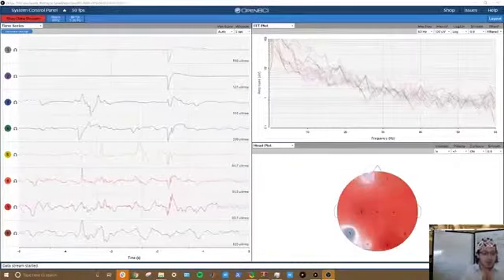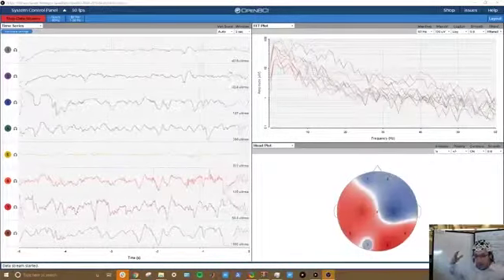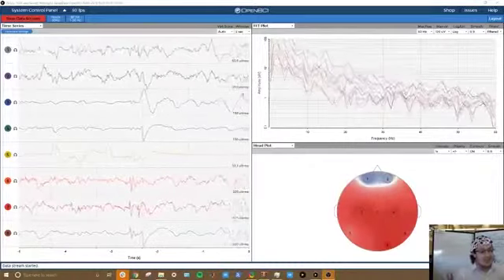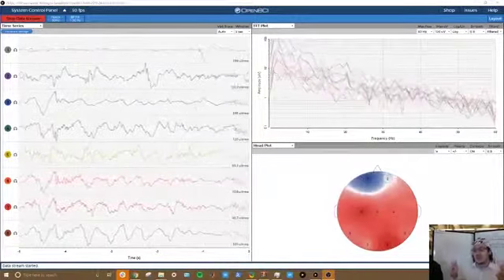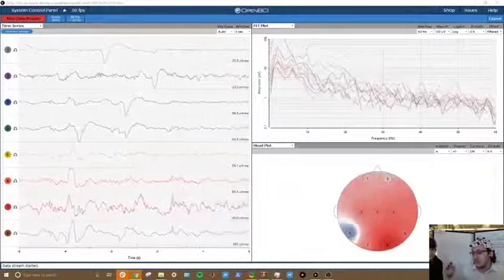So the goal is we're going to take what's going on in this EEG that I'm wearing right now. You see this here? I have become the brain-computer interface. The BCI is going to be sending data over what's called Lab Streaming Layer, or LSL. And LSL is awesome because you can do literally anything with it.